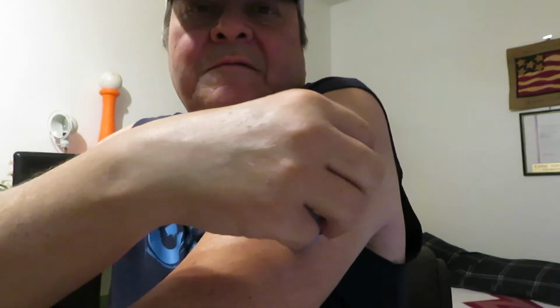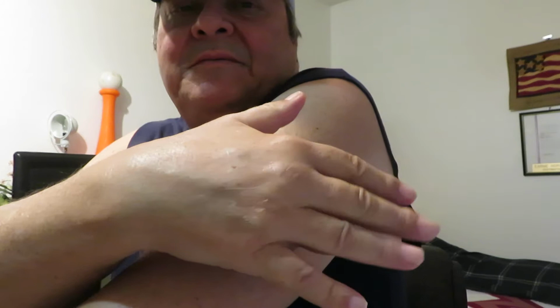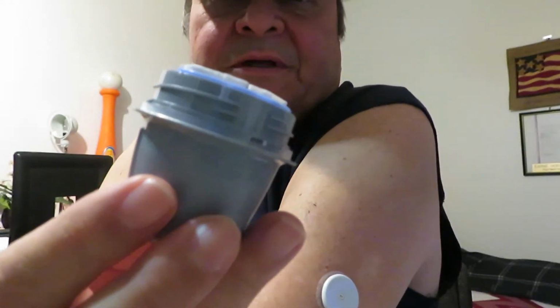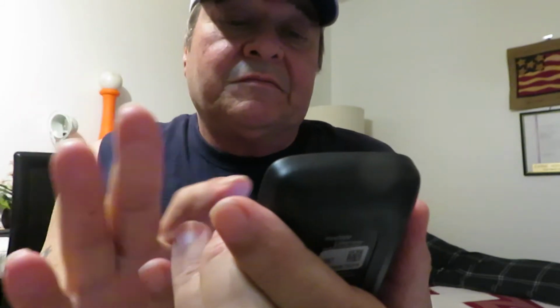Now I just take this thing, push down like that. It was really simple. Pull up. There it is. Super simple. Didn't feel a thing. Didn't feel it at all. If you ever had a tetanus shot, you can feel it. That's the least painful one of all. But that one, you can't even feel nothing. So there it is. It's on. Now the sensor told me, start new sensor. Start new sensor, and I'll just punch it, do what it says, start new sensor.